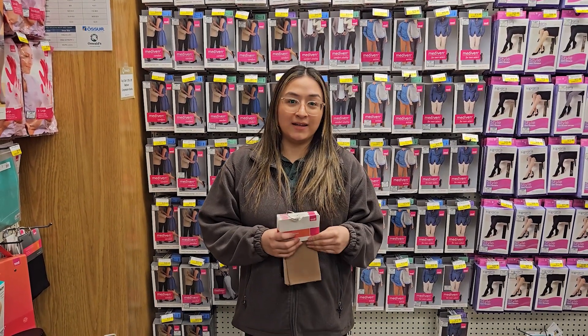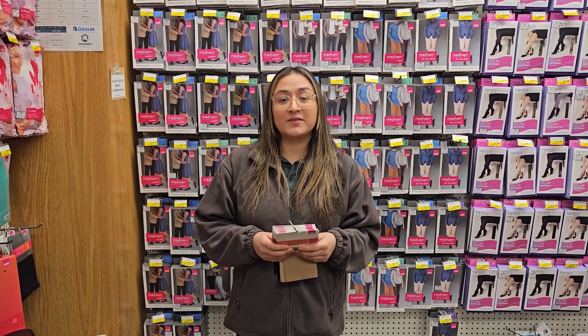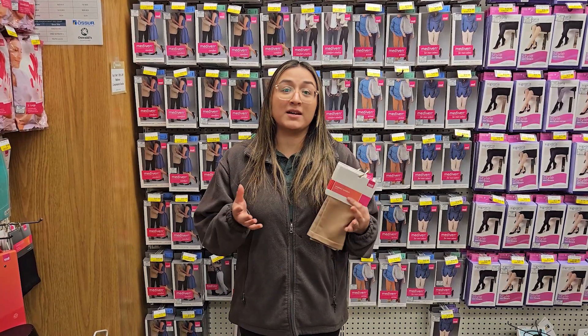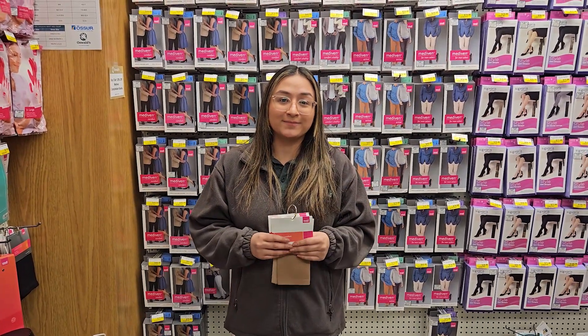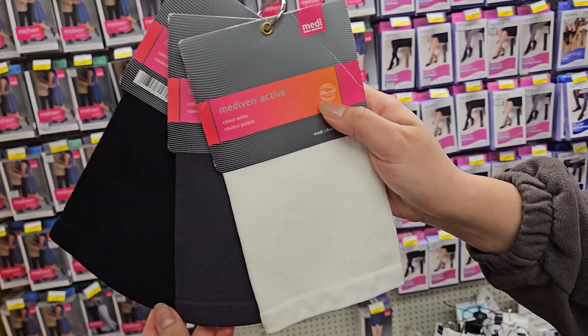The preferred brand here at Oswald's Medical will be Medi. Why do we prefer this? We really like the variety of sizes they carry, so it seems like this ready-to-wear sock will be customized to fit you perfectly. Medi will have different styles and colors that you can choose from.